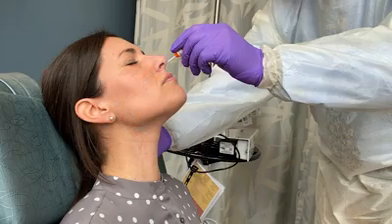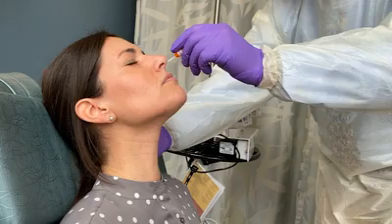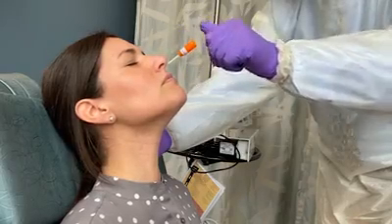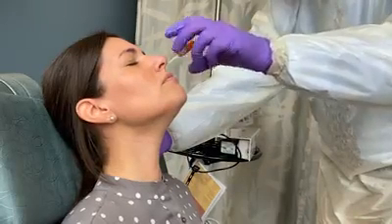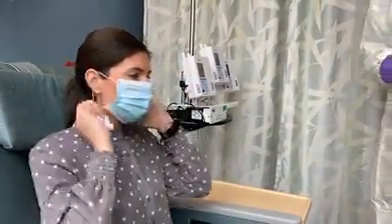The CDC recommends leaving the swab in place for several seconds to absorb secretions, and then slowly removing the swab while rotating it. Your institution may also recommend rotating the swab in place several times before removing it. Ask the patient to reapply her mask.